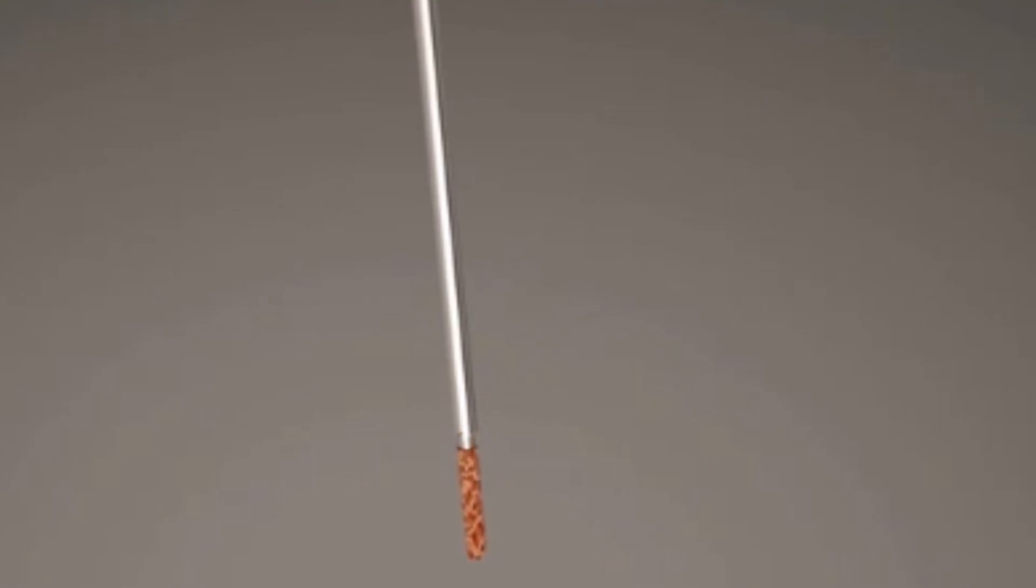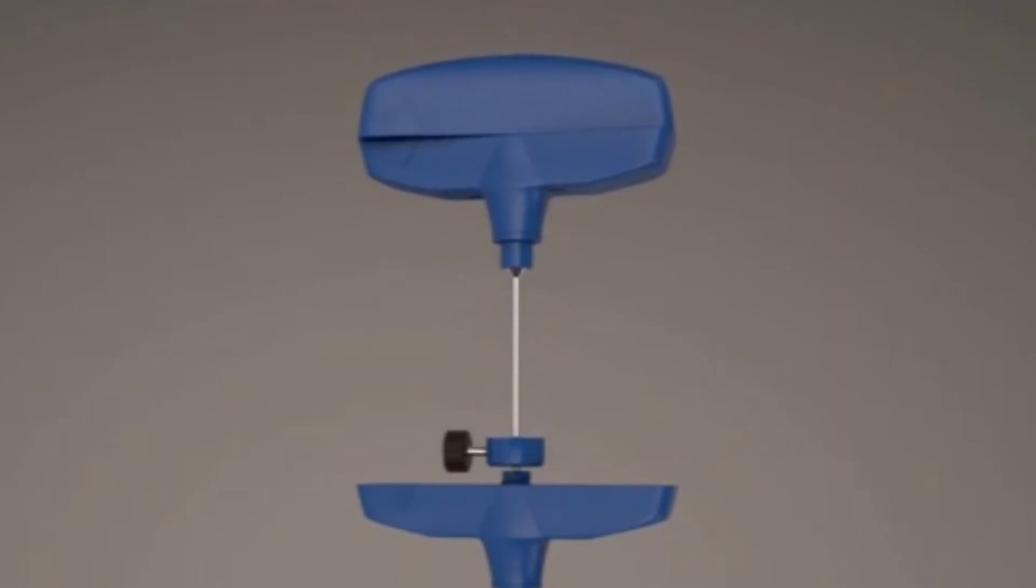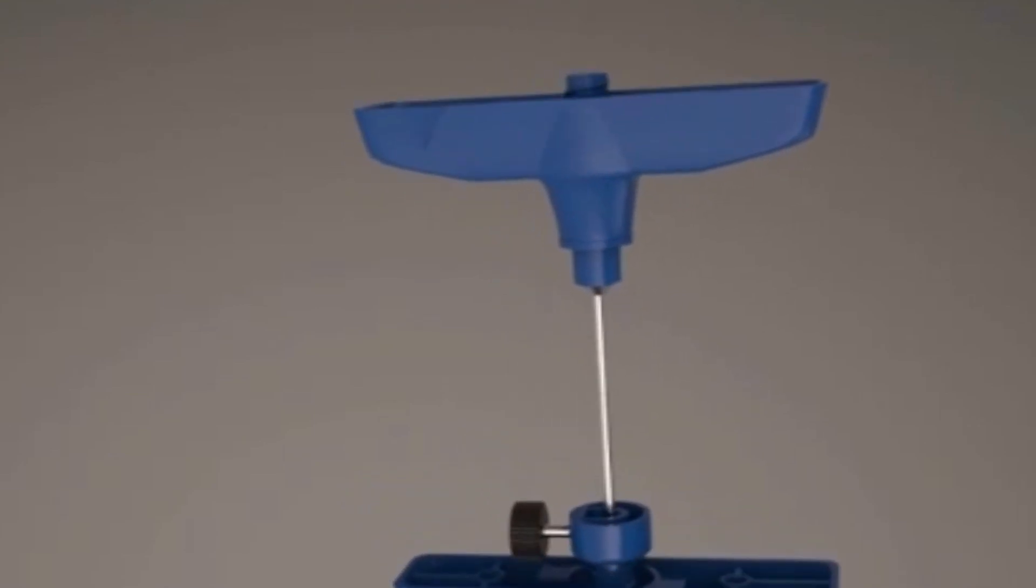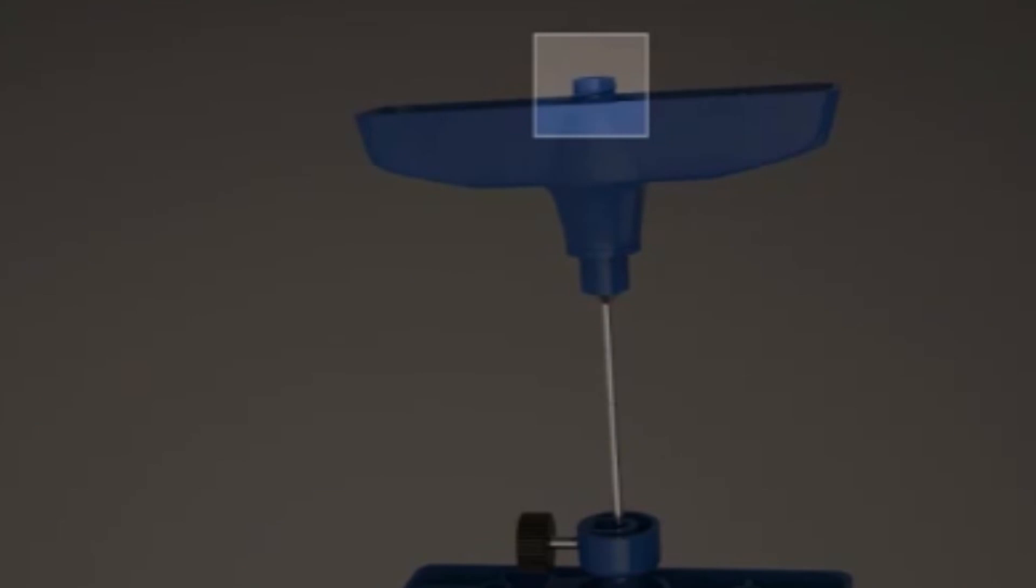The biopsy needle can be reinserted through the cannula to obtain additional samples. If aspiration is required to sample a lytic mass or gather blood, a syringe may be attached to the lure lock feature of either the biopsy needle or cannula.